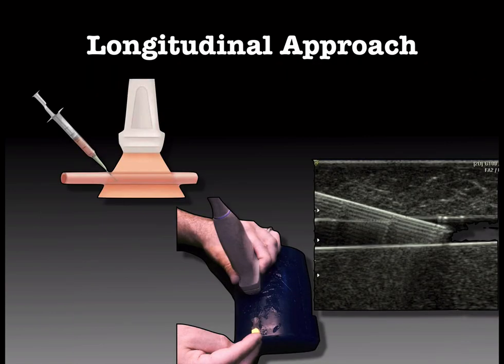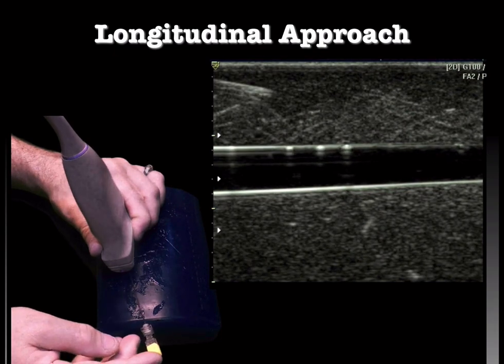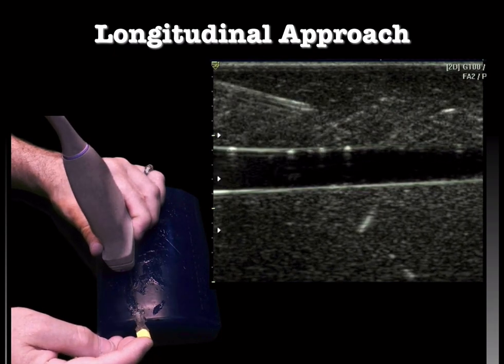Now in long axis, we turn to where the vein has two parallel walls. The anterior and posterior wall are just bright lines. And then we insert our needle under the short face of the probe so that it's a bright line, and we place all three of those lines together. Seems very easy, and in practice is quite difficult.